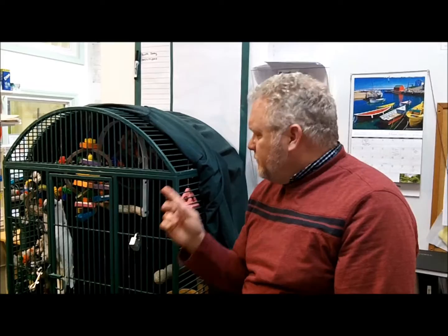We're about to show you a video on a cloacopexy on this bird — a baby umbrella cockatoo. She prolapsed her cloaca, so we went in and repaired it, and the video will show it quite well. This is a common problem in cockatoos, and there's no other good way of repair — it really requires surgery.